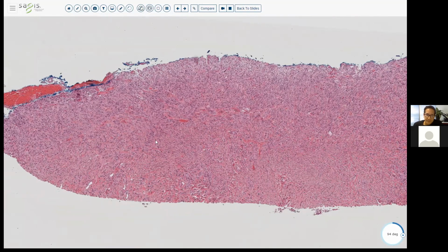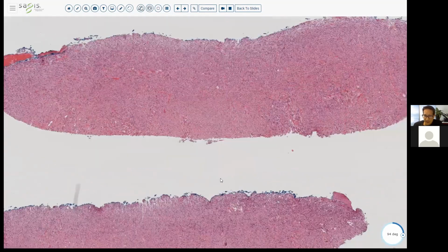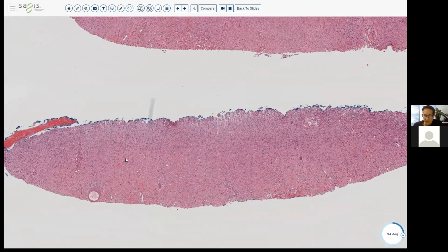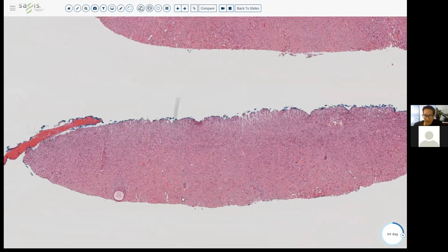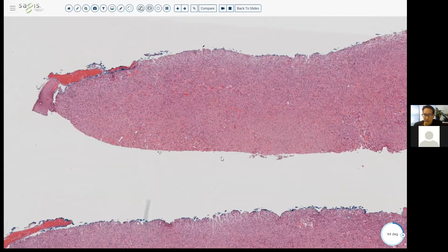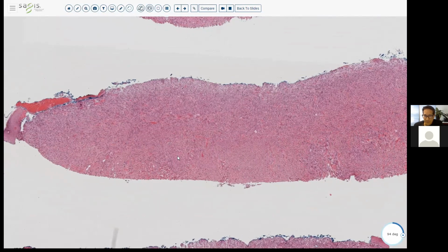So really, once you determine that it's a spindle cell neoplasm, usually in older patients on sun-damaged skin, you want to just rule out everything. And once you've ruled out a melanocytic lesion or a carcinoma, or even a vascular tumor with CD31, and then you can show that it's SMA positive and factor 13A positive, you're confident that it is an atypical fibroxanthoma.